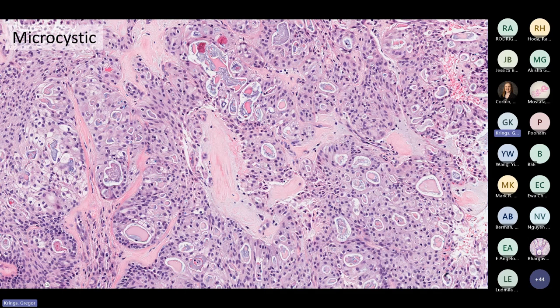It's typical of these tumors, and you can see the prominent extracellular secretions that are either eosinophilic or a little bit more mucinous. Also, the stroma is very characteristic of these tumors, often being a sclerotic to hyalinized matrix.